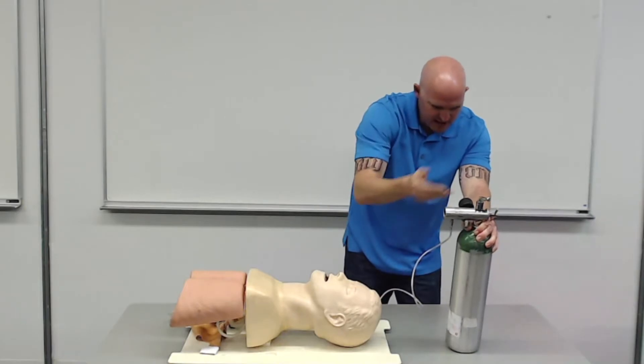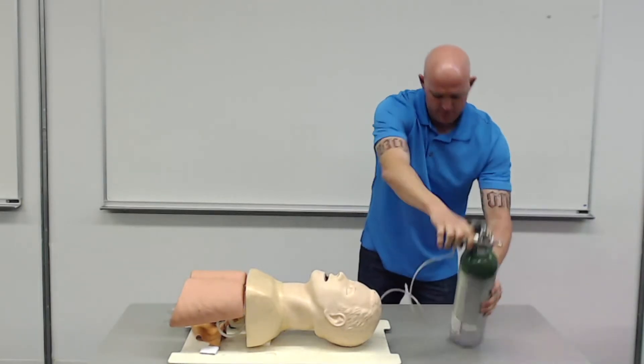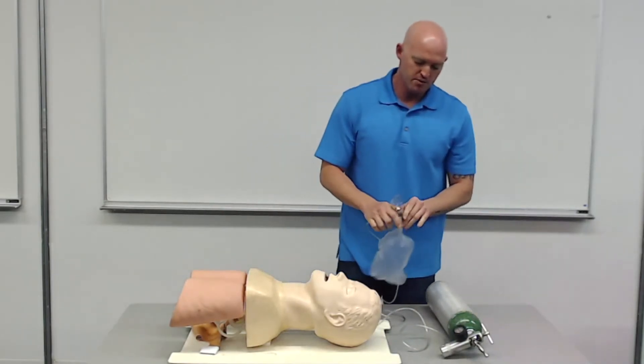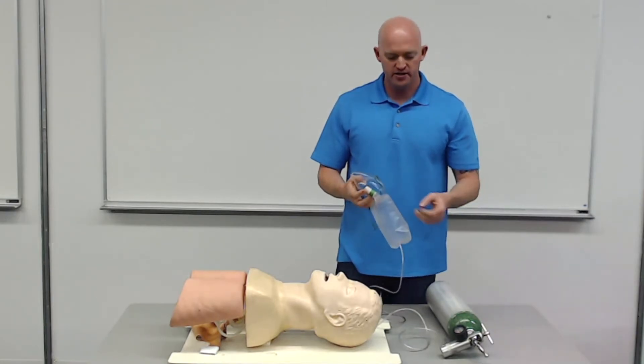Always lay your bottle down, never leave it standing up. I'm going to pre-fill my reservoir. Make sure we don't overfill it because it can pop fairly easily.